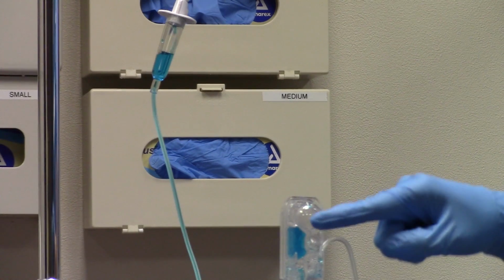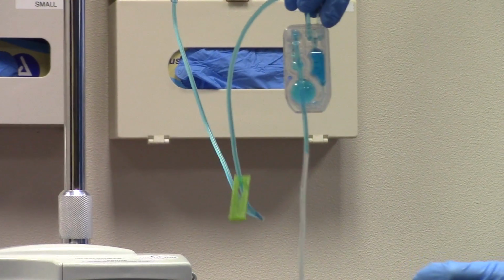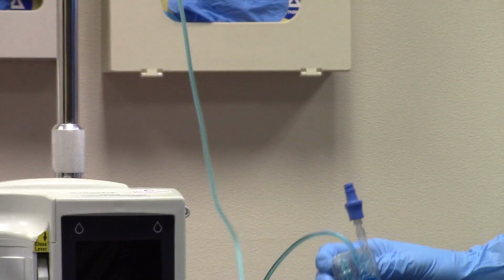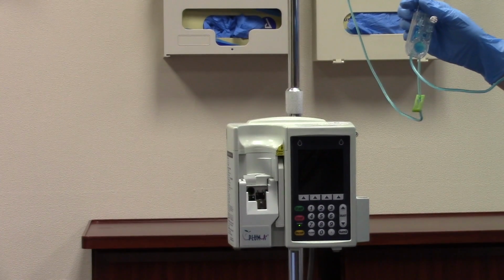It starts to fill. As soon as it fills, I'm going to turn it over and allow the circle to fill. Now my cartridge is fully primed, and I can allow the rest of the tubing to prime by gravity. Now our tubing is primed and ready to load in the pump.